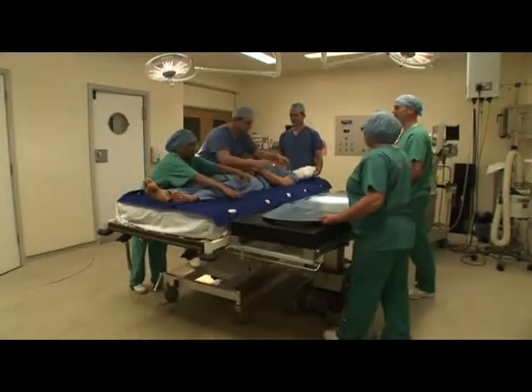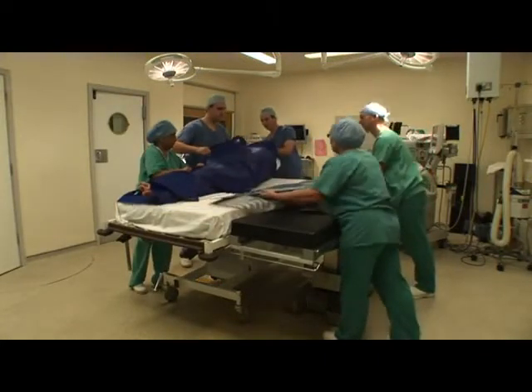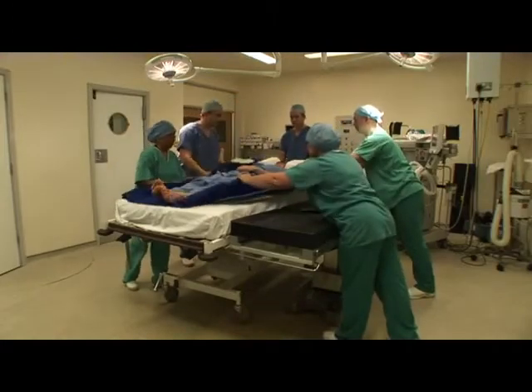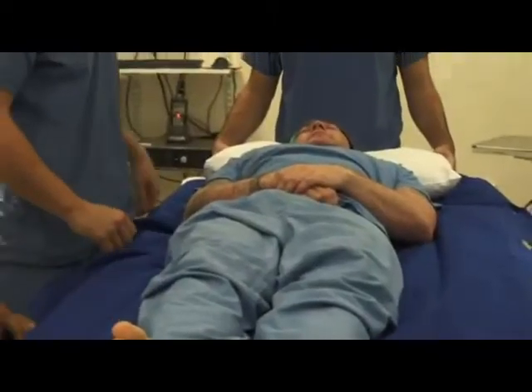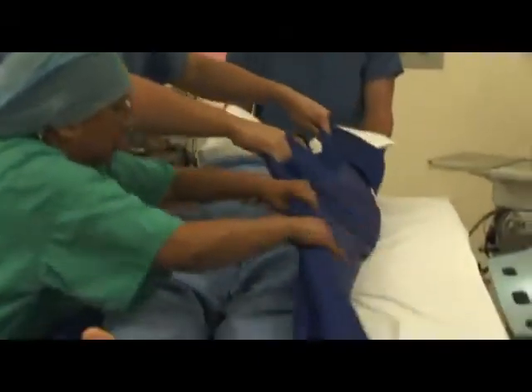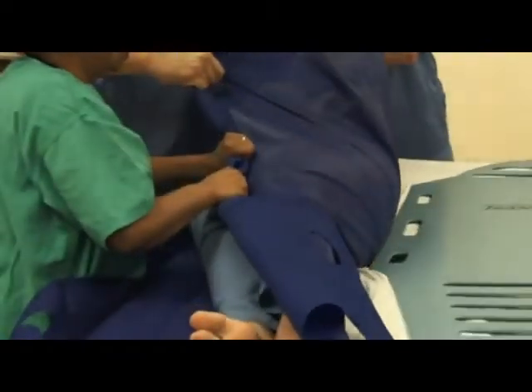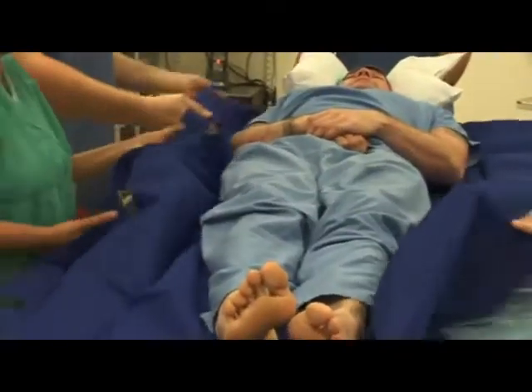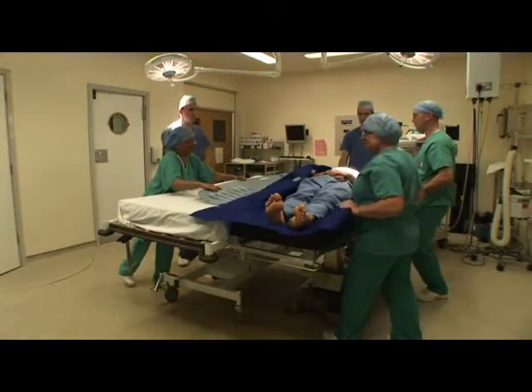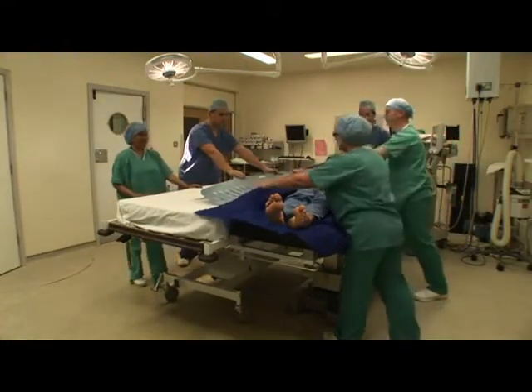Theatre staff 1 and 2 stand on one side of the patient, with another staff member supporting at the head. Roll the patient onto their side with the assistance of the FlexiSlide. Theatre staff 3 and 4 stand at the opposite side to insert the PatSlide under the FlexiSlide to bridge the gap between the offering and receiving surfaces. Staff 1 and 2, with an anaesthetist, lower the patient into the supine position.